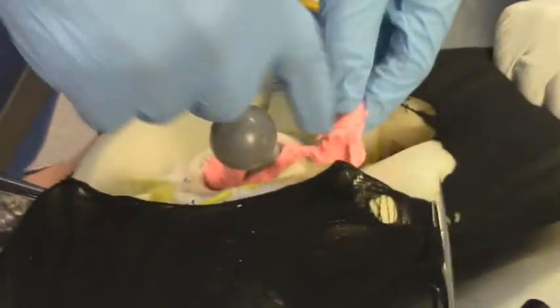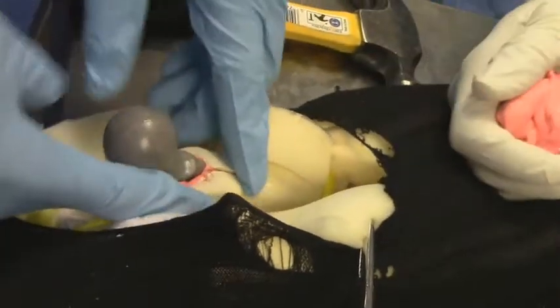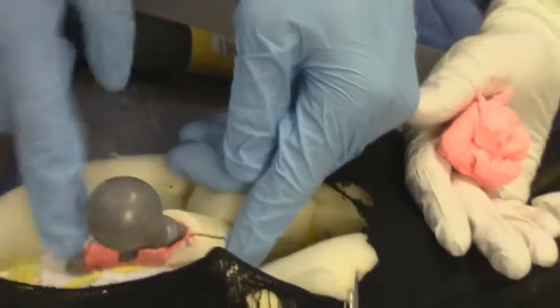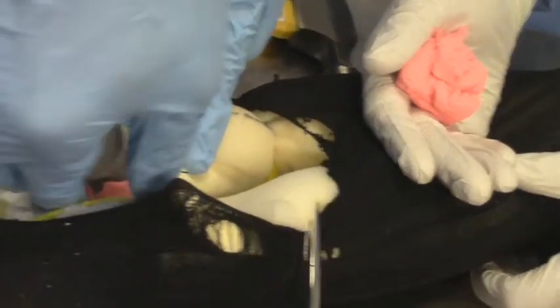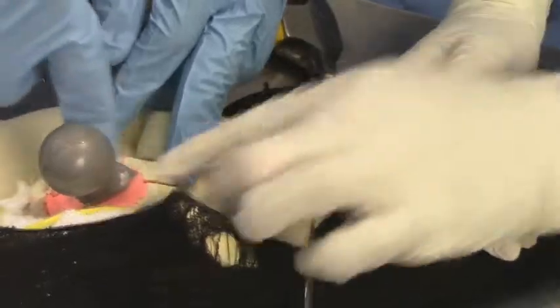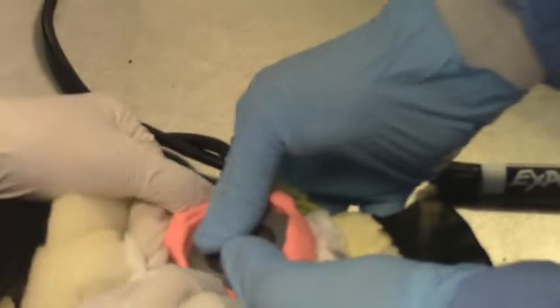You can pack the femoral cavity with cement or coat the implant or both to secure the femoral component in place. Fractured femurs should be stabilized with a zip tie to close down the fracture. Use firm pressure to fully seat the implants into position. The simulated cement will likely ooze out between the implant and the bone. Use a finger or instrument to remove any excess cement.